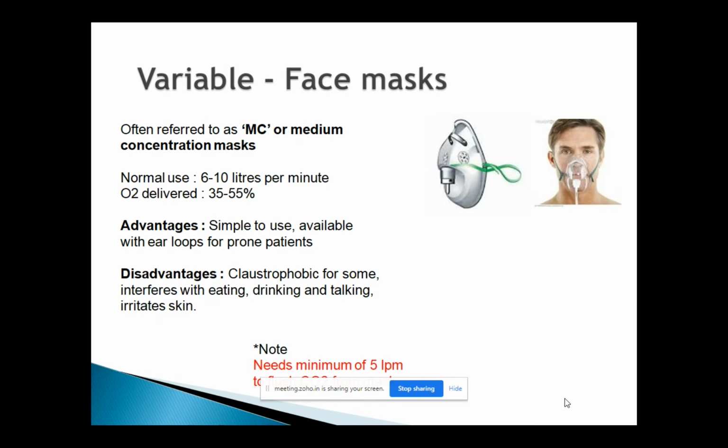Of course, you know what patients are breathing out is carbon dioxide. It is likely that the flow is not good enough to flush the CO2 coming out of the patient's nose. The patient may end up breathing in what they are breathing out. So if it's a simple face mask, something you need to know, the minimum flow required for that particular device is anything from 5 liters to 10 liters, not less than that.